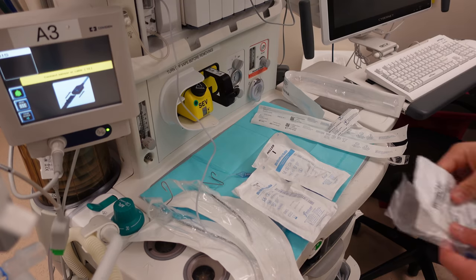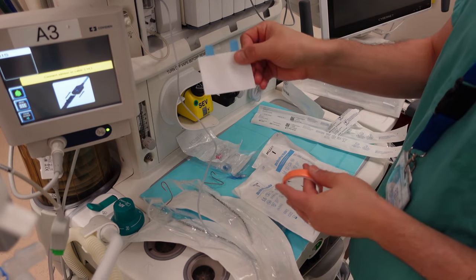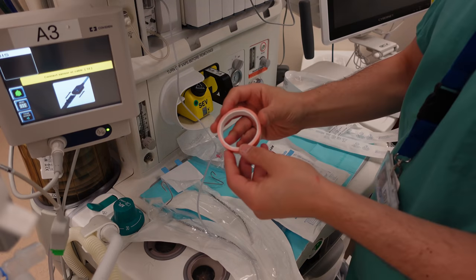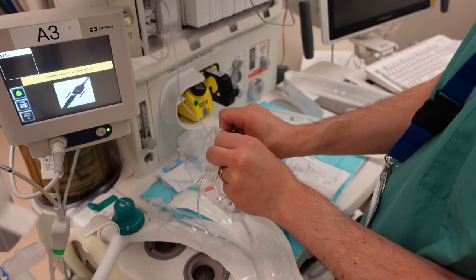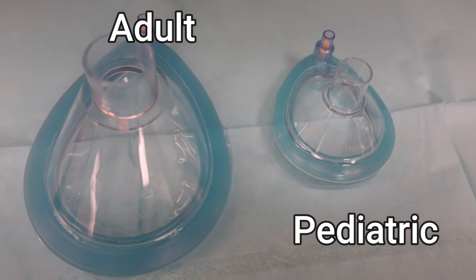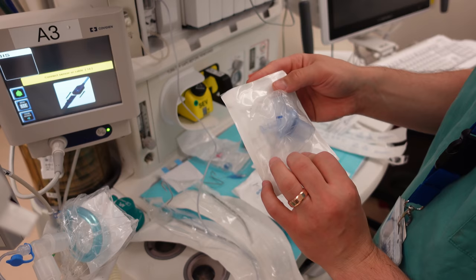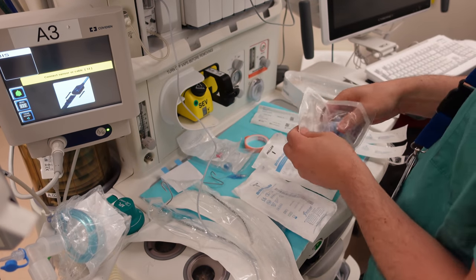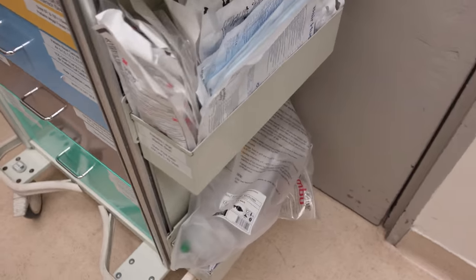Other components of my airway setup include several oral airways in case I'm having difficulty ventilating the patient with a mask and need to prop open their airway. I also want eye tape available to protect the patient's eyes from corneal abrasions, tube tape to secure the endotracheal tube, and several different mask sizes to fit over the patient's nose and mouth. Lastly, a heat and moisture exchanger helps keep heat inside the breathing circuit, which is a big source of heat loss during surgery. I also make sure I have working self-inflating resuscitation bags in a couple of different sizes.